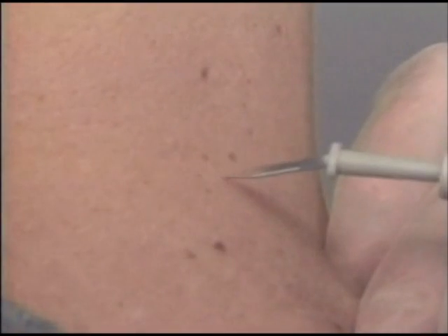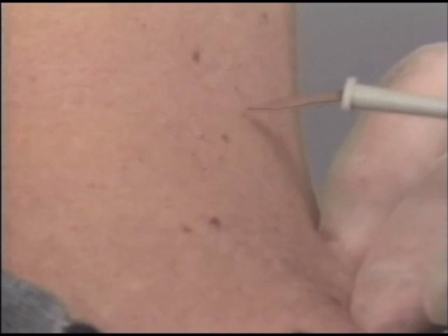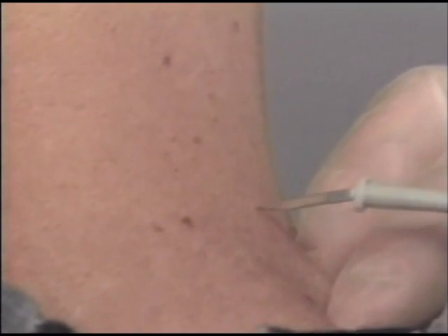Electrosurgery is best for numerous tiny skin tags. It may be treated quickly in one visit. The lesions dry up and fall off over the next few days. One to three watts are applied for less than one second. If the lesion is unusually large or looks suspicious, it should be biopsied and sent to pathology.